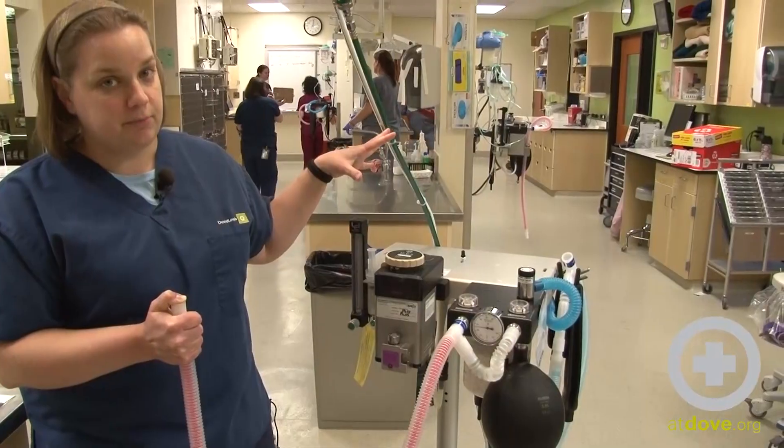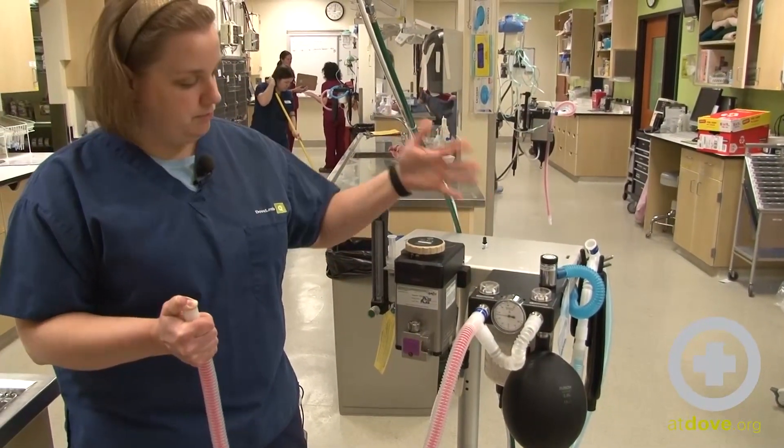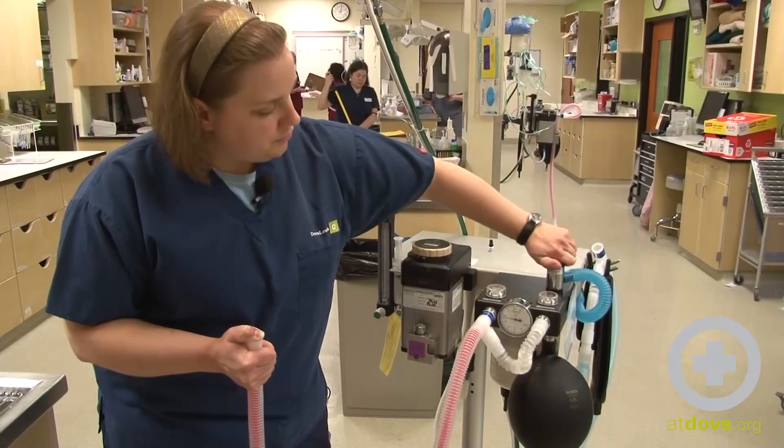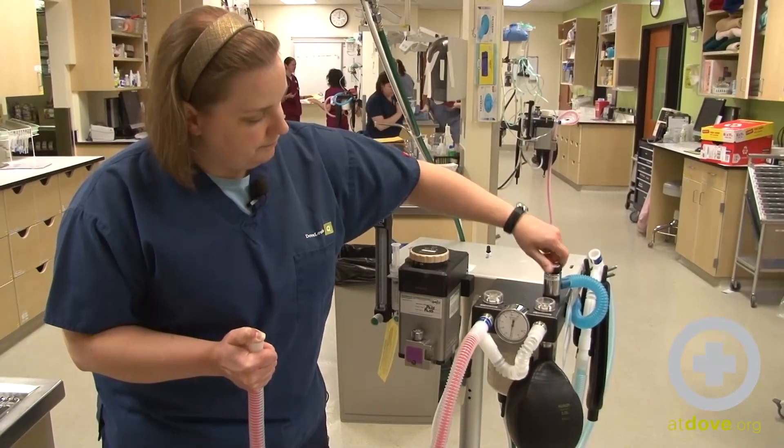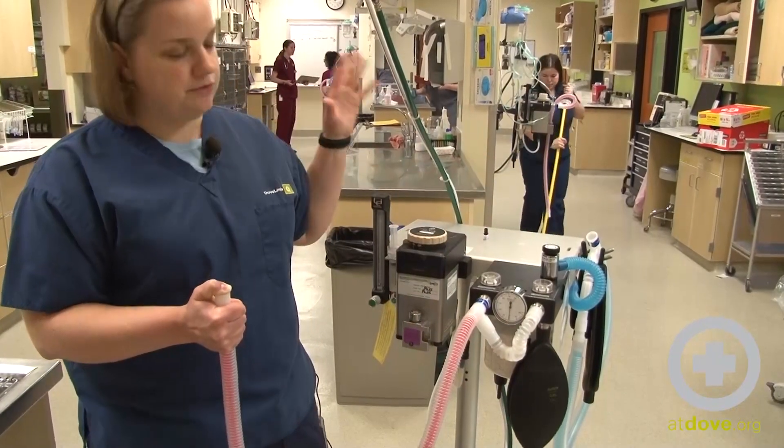You want to make sure your scavenging system is hooked up correctly. So this is a good test. You want to wait about five seconds. Everything looks good. So I'm going to release the pop-off valve and make sure that I have all of this leaving through the scavenging system.